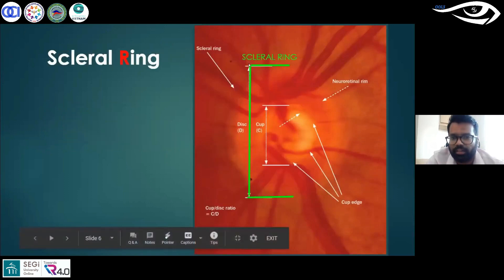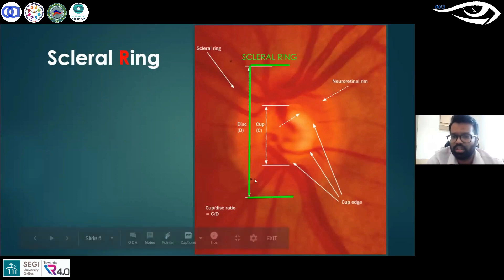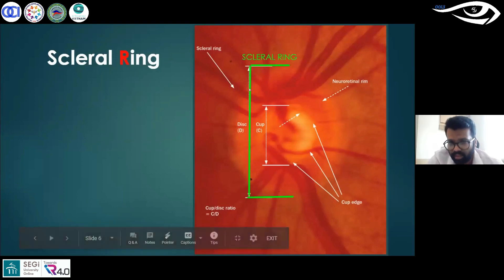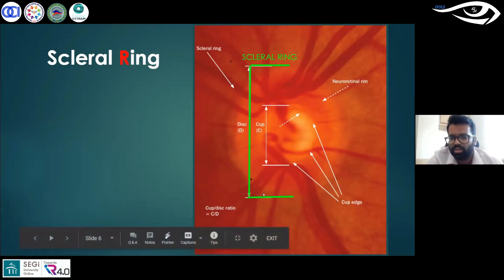The scleral ring: when we look at an optic disc, the outermost ring that you see is the part of the optic nerve that has pierced through the sclera to enter into the eye. That outermost rim is known as the scleral ring. It is used to measure the absolute size of the optic nerve head.